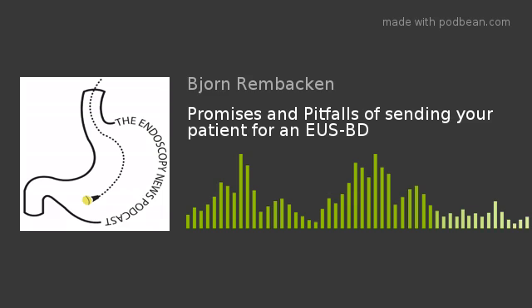So would that mean an additional surgical procedure, or would you tackle the bypass endoscopically? There's two ways that we do this, both endoscopically under the same anaesthetic. We either perform a duodenal stent at the same procedure immediately after the EUS-guided biliary drainage, or we do something called an EUS-guided gastrojejunostomy. That's another novel technique that we've been performing in a very similar cohort of patients. As a single step procedure, the stomach and the duodenum are drained, there's less chance of the stent being blocked by gastric contents, the flow of bile is preserved into the duodenum, and there's no risk of obstruction from the duodenal wall.